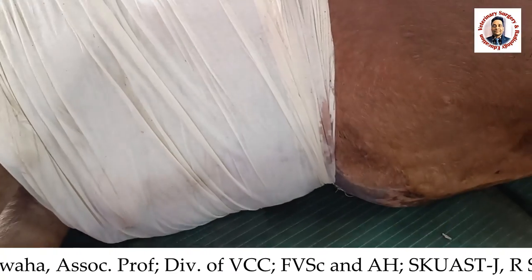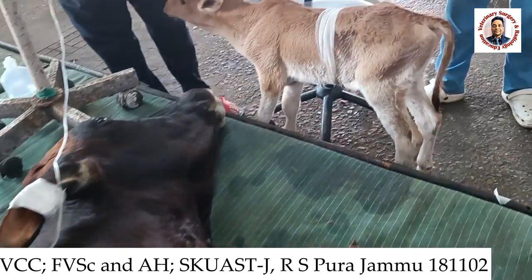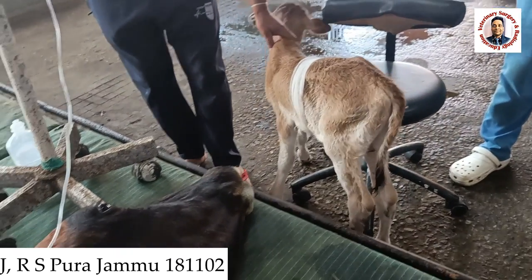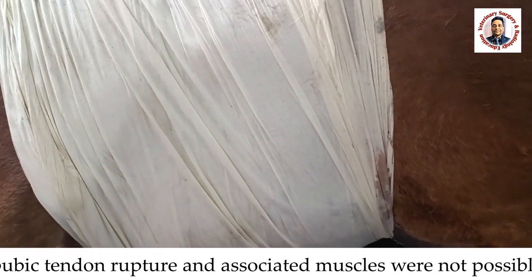We have performed the caesarean section. By caesarean section, we delivered a live fetus — a healthy male calf, as you can see. However, the peritoneum and the prepubic tendon were ruptured, and only the superficial muscles were intact. The prepubic tendon which was ruptured is very difficult to repair, and the muscles were also very weak — they cut through when we applied sutures. We repaired whatever supportive structure and subcutaneous tissue we could.